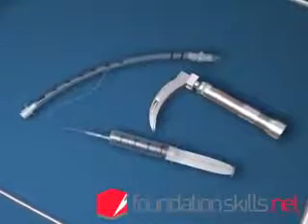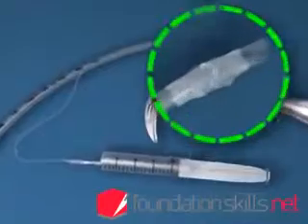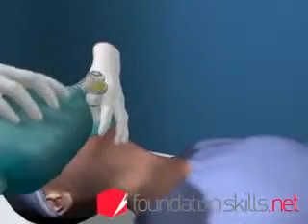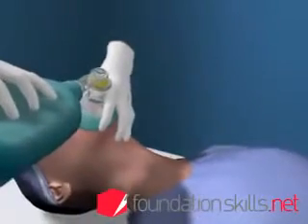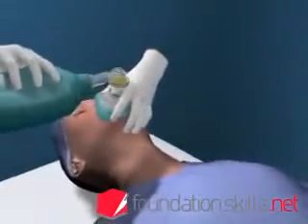Ensure that the equipment is prepared and check that the laryngoscope is working and the cuff on the tube inflates and deflates properly. Pre-oxygenate the patient with bag and mask ventilation for up to 1 minute before attempting to intubate.